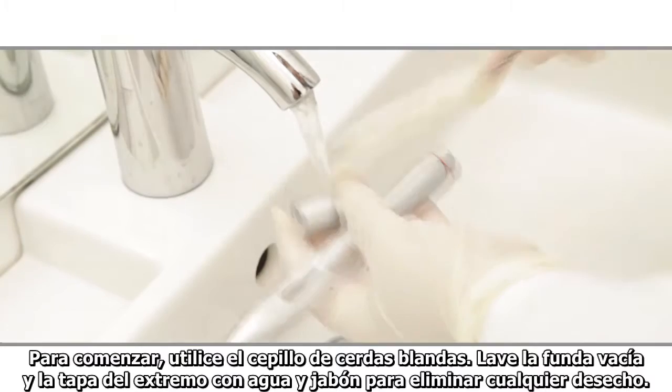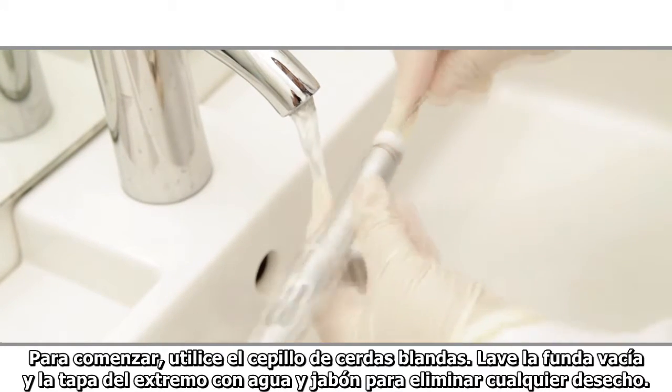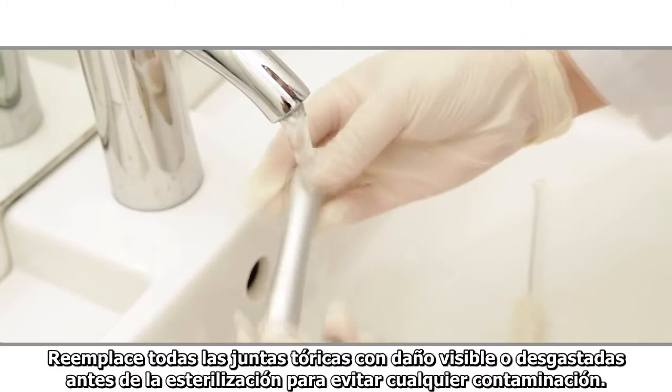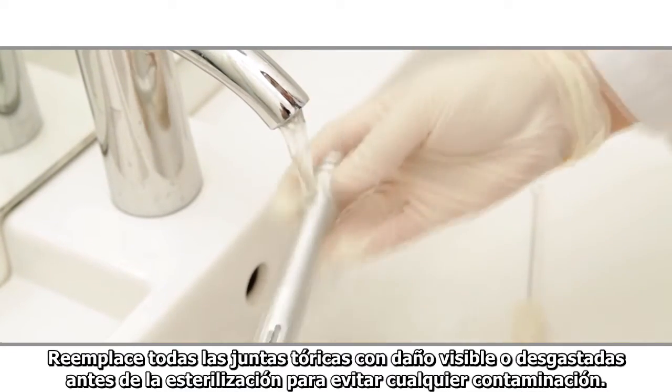To begin, use a soft bristled brush and wash the empty sheath and end cap with soap and water to remove any debris. Thoroughly rinse with water prior to sterilization. Replace any O-rings showing visible damage or wear prior to sterilization to prevent any contamination.